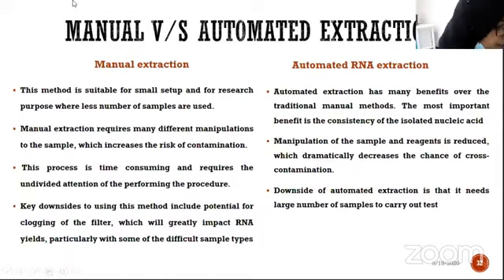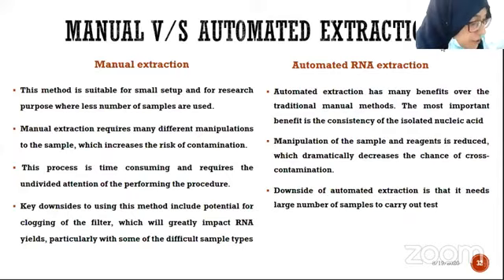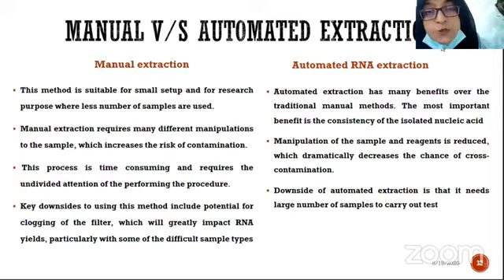We have some more questions. First is, do you use replica of each patient sample? If yes, then how many replica are used in automation? Usually we do not use replica while we are dealing with the COVID-19 sample because of the cost. If we are using the replica, it will increase the cost.